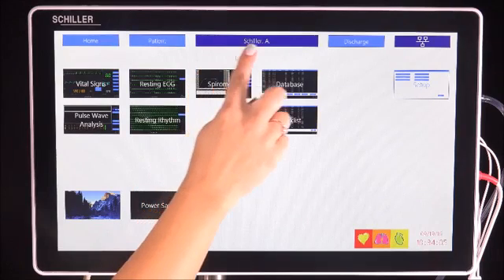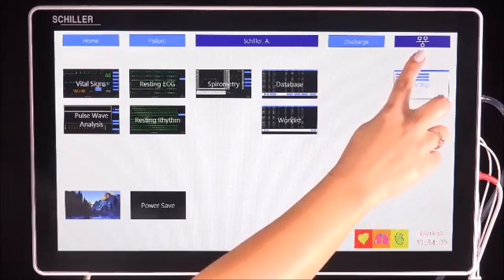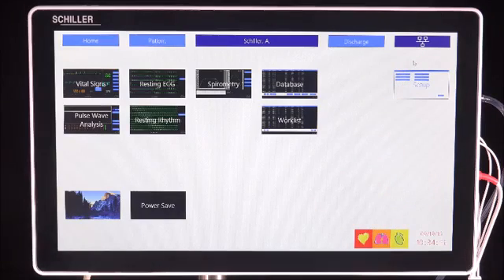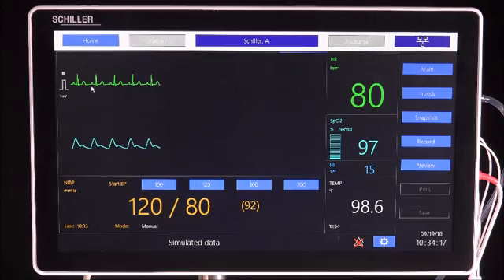On the top of the screen, the patient's name can now be observed. The top right of the screen indicates battery and network state. When selecting vital signs, all of the patient's parameter information will be displayed. Values are only displayed when the ECG cable or at least one sensor is connected.